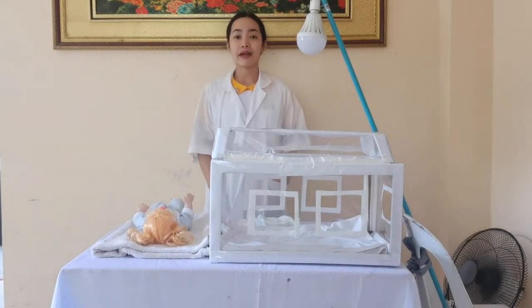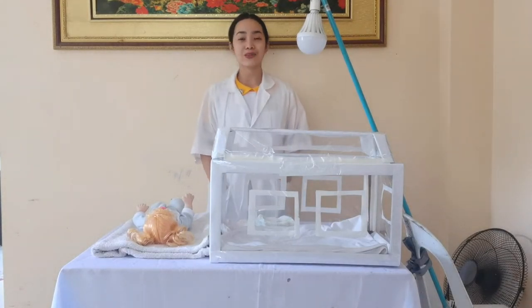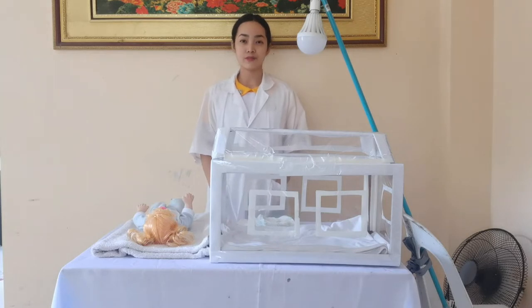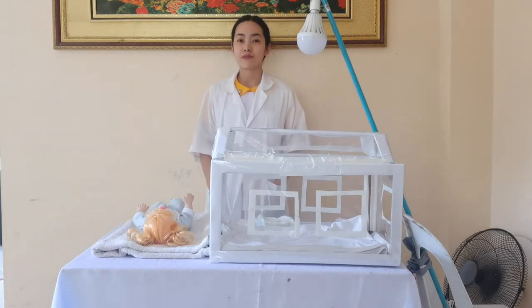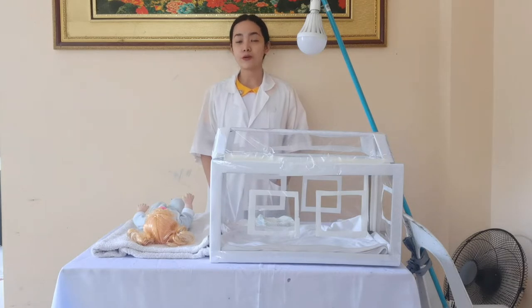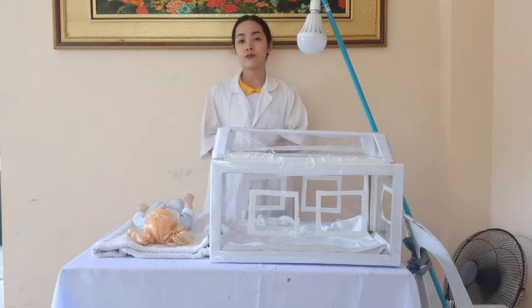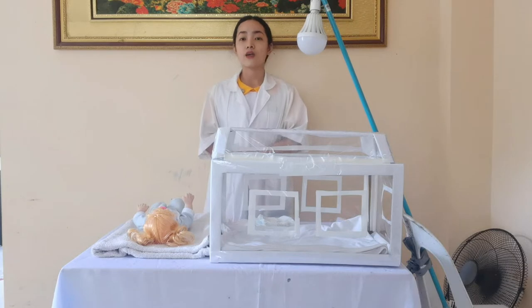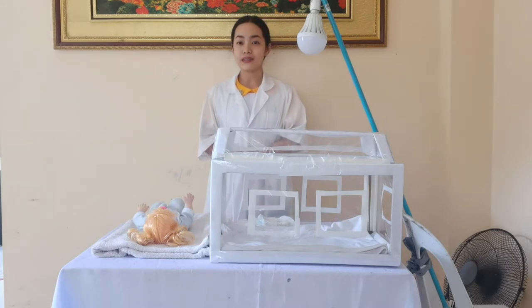Good day. I am Ira Lagas of BSN23, and today I will be performing the return demonstration for the procedure of phototherapy. The purpose is the application of fluorescent light into the infant's exposed skin, used to break down the bilirubin in the skin.